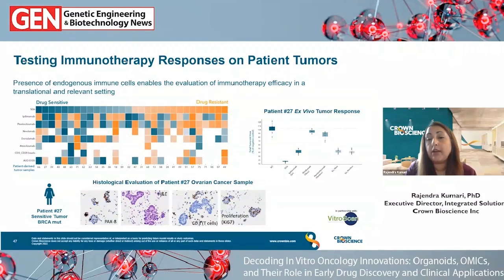However, this can be very much dependent on the tumour and how hot or cold it is, and the level of immune cell infiltration at the time of that tissue collection. So here, the infiltration of CD3 positive T cells, as well as other markers like Ki67 for proliferation, or markers for ovarian cancer, can also be assessed by IHC, just to get some more information about why the tumours may be responding to those immunotherapeutics. So this assay is actually very versatile, and obviously the limitation is on that tissue sourcing and the amount. For example, for triple negative breast cancer, it's very easy to get tissue, whereas for other subtypes it may be less so.